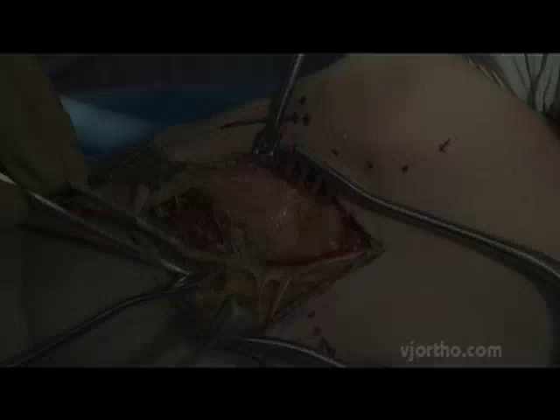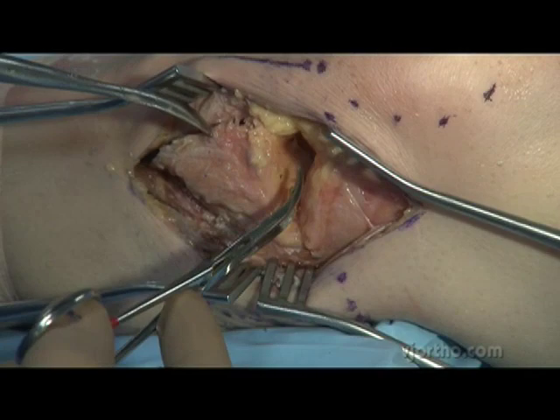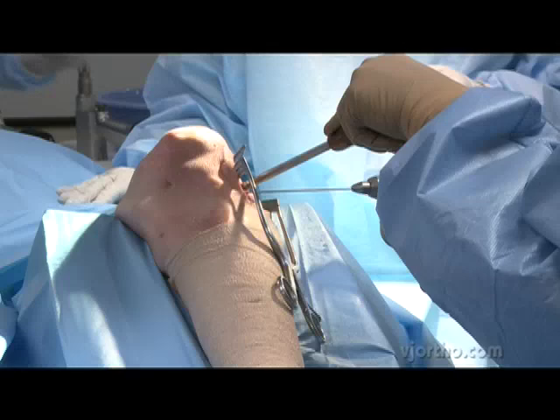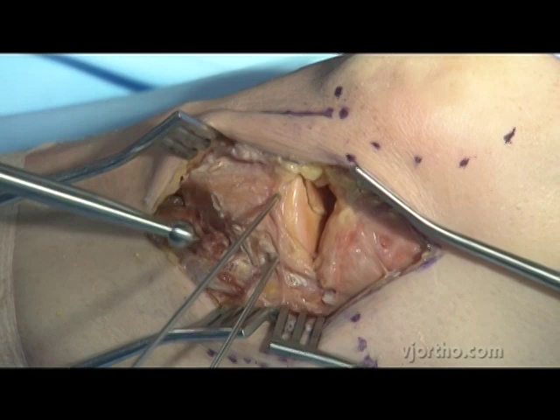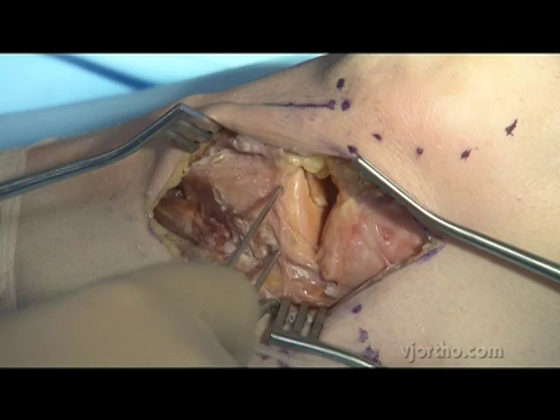There's our articular fracture — it's unstable — and it's too small a piece to put a screw in to hold it. I'll place two wires: one posteriorly at the joint edge, then a second wire. Now I've got two joysticks in this fragment to correct any alignment or rotational change.